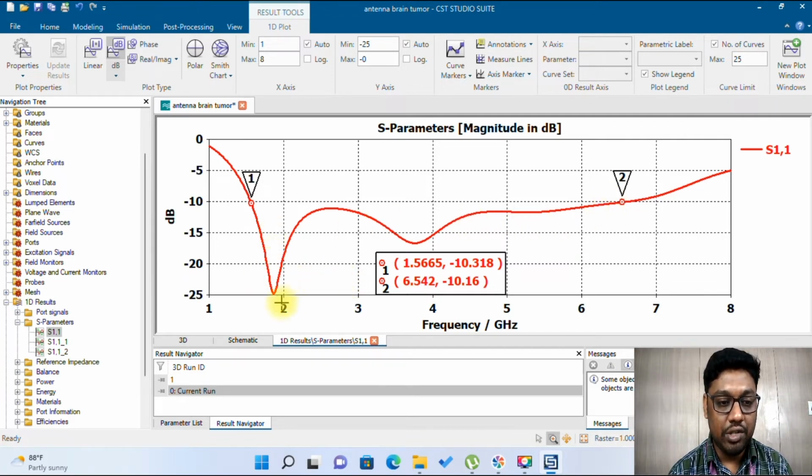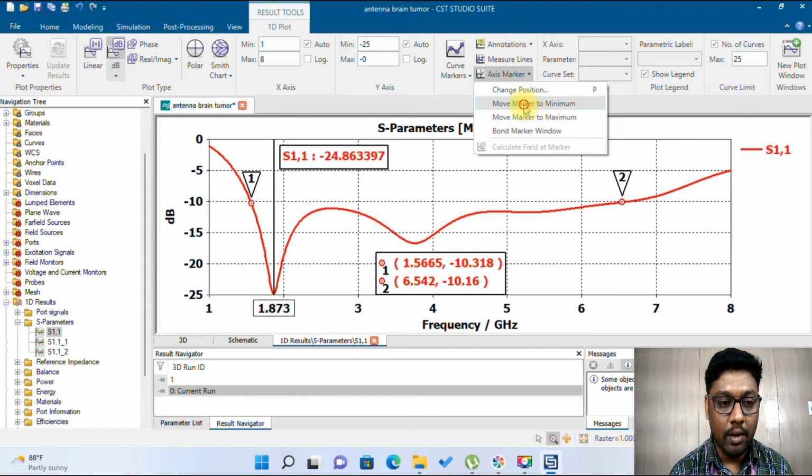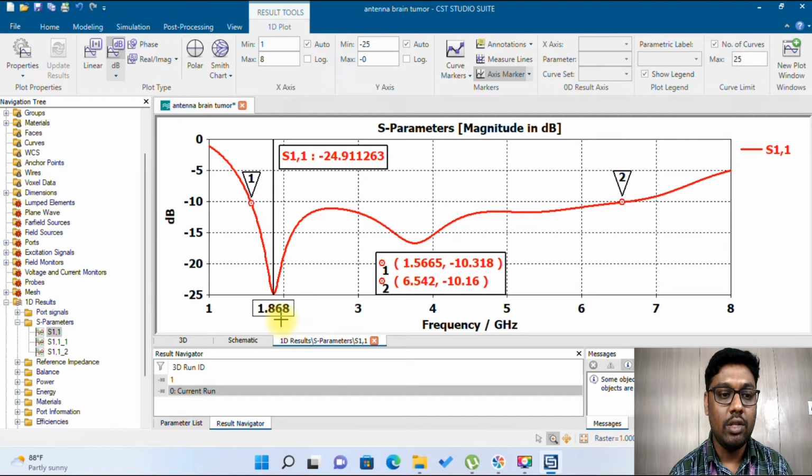And we have one resonation point. So the resonation point is, I'll put a marker. So the resonation point is around exactly 1.8 gigahertz. So that's the lower band of UWB. It starts from 3.1, but since the application is brain tumor detection, we need to get the resonation frequency in the lower band.